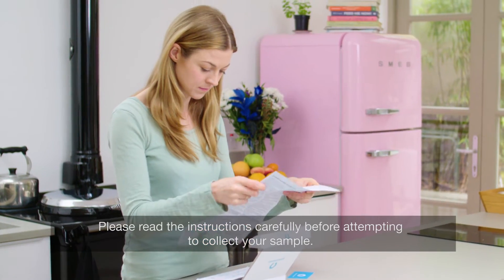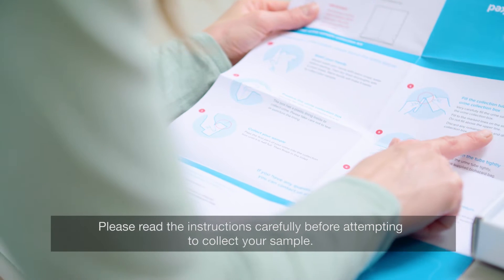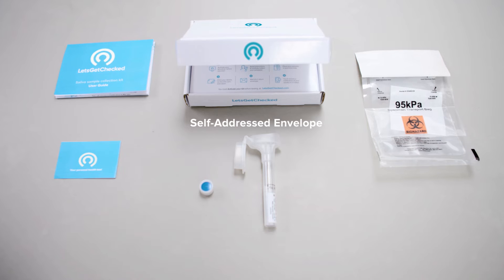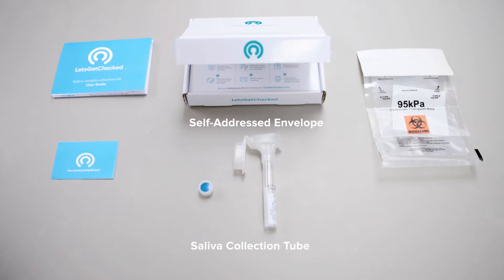Please read the instructions carefully before attempting to collect your sample. Your sample kit contains a self-addressed postpaid envelope, saliva collection tube, a biohazard bag, a patient ID card and a set of instructions.